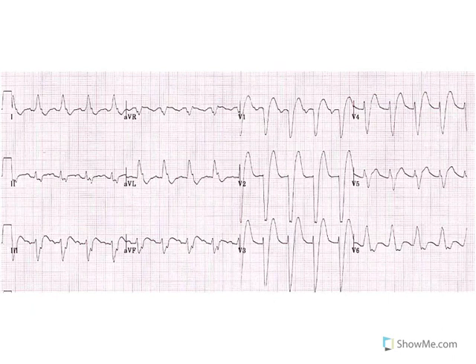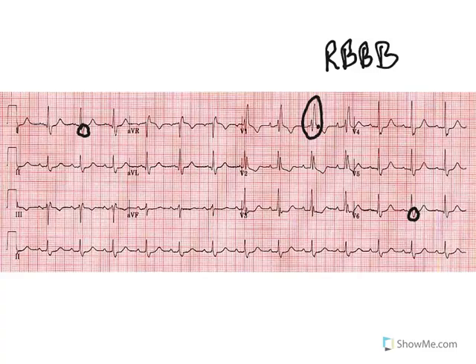So here's the thing about this: most of the time what we've said is you cannot tell with a left bundle branch block whether or not that patient also has a STEMI. Well, that's complete bullshit. I've told you it's bullshit. Because we can tell. And what we use is Sgarbossa's criteria. And what Sgarbossa's criteria says, there's Sgarbossa A, there's Sgarbossa B, and there's Sgarbossa C.